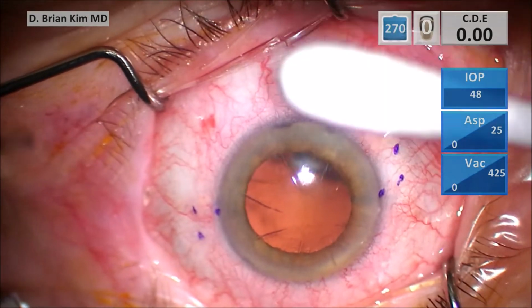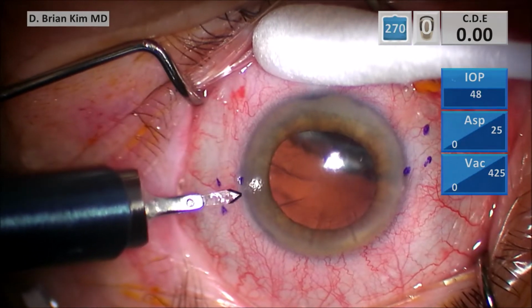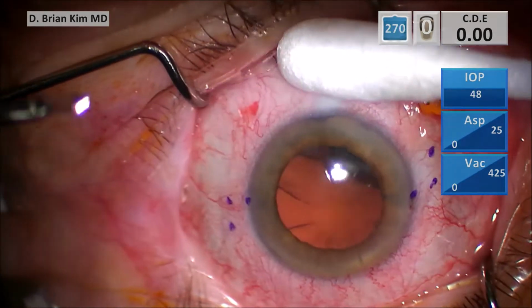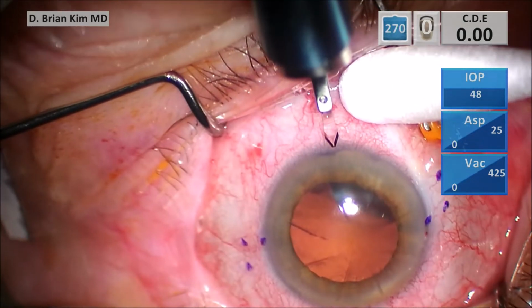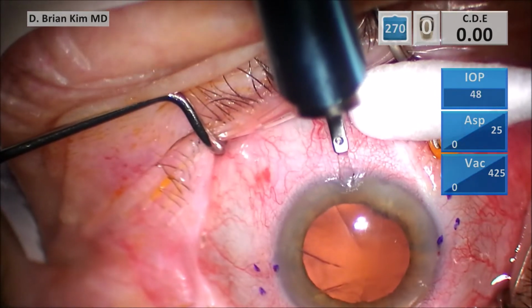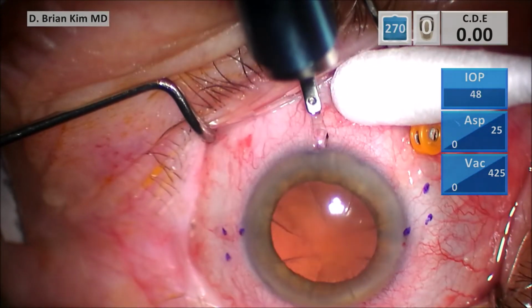This is the angled paracentesis blade from Diamatrix, and by using this angled blade, you have easier access, especially in these areas where the nose is in the way. It's much easier to be able to make a nice flat approach for your incisions. And also, of course, this patient's had RK, so you have to kind of navigate around those incisions as well.